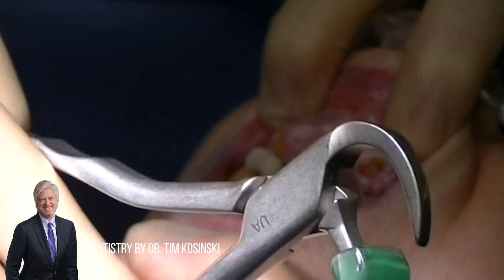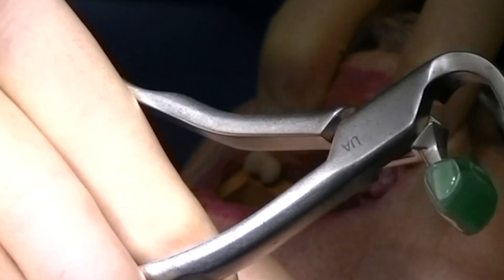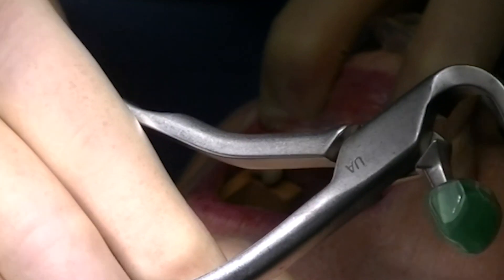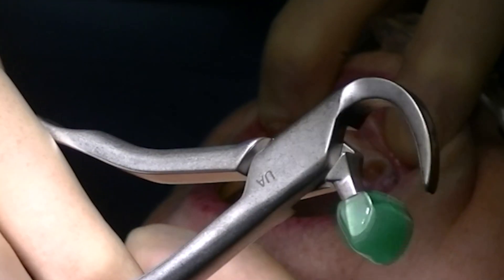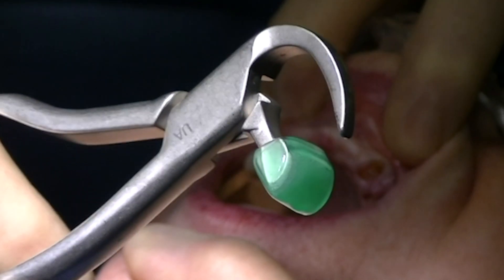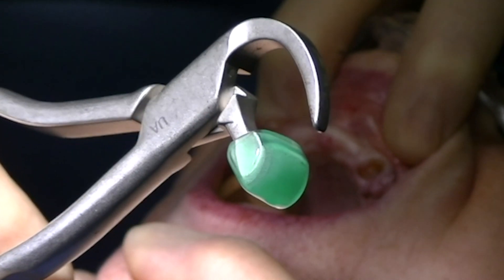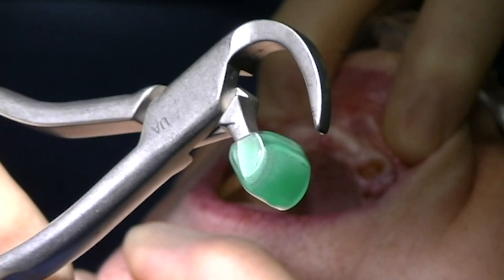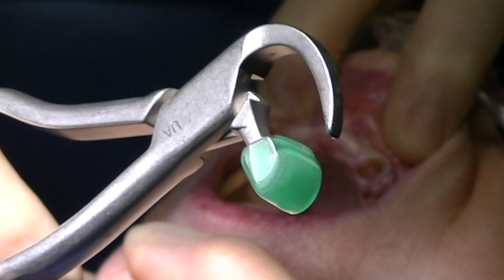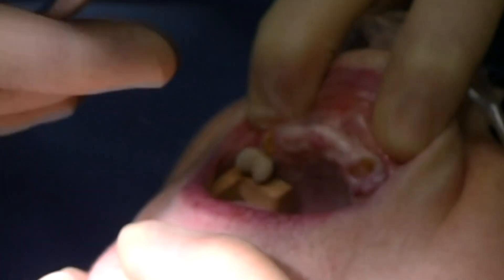The beak, or the shovel-shaped edge, will engage the palatal aspect of the non-restorable tooth, 1-3 mm subgingival. The bumper, which you can see here, has a green sheathing soft cover on it and is not the working end of the instrument. Rather, it provides a fulcrum or a center of rotation for the instrument to atraumatically remove the tooth up and out of the socket.